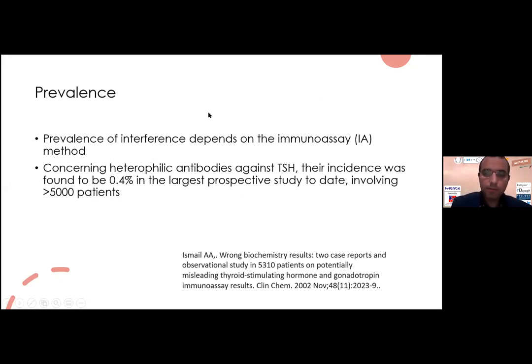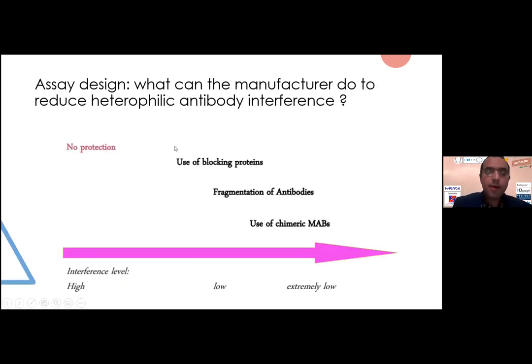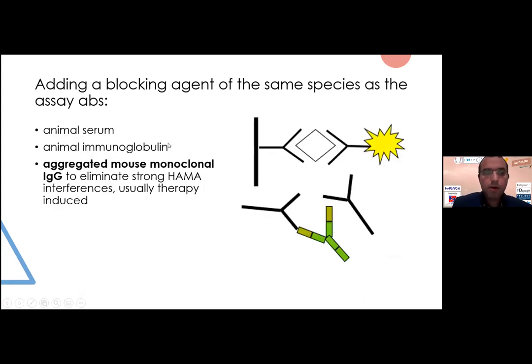The prevalence of interference depends on the immunoassay. In a study of 5,000 patients, the incidence of heterophilic antibodies against TSH was found to be 0.4% — not very common, but it exists. Manufacturers can reduce heterophilic antibody interference using blocking proteins, fragmentation of antibodies, or chimeric antibodies. A key approach is using blocking immunoglobulins that block the action of heterophilic antibodies, leaving TSH free to be sandwiched by the capture and detection antibodies.